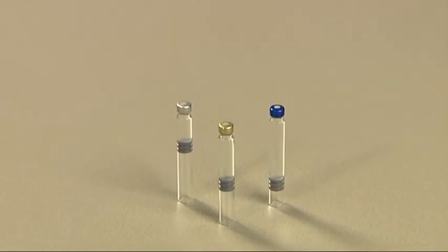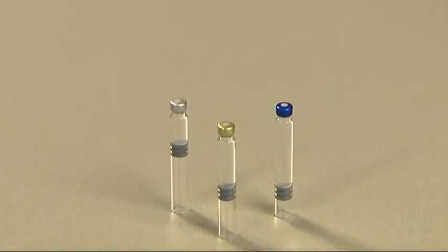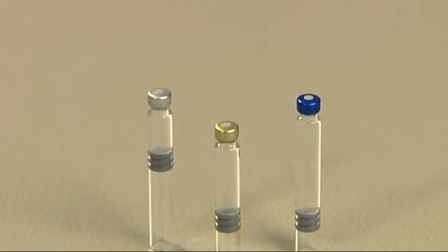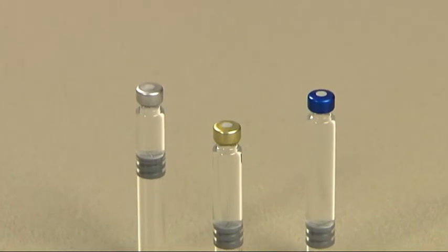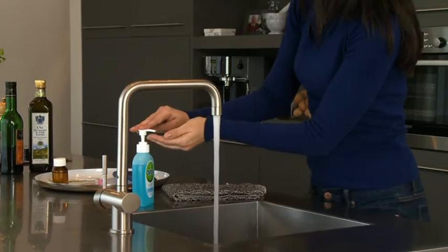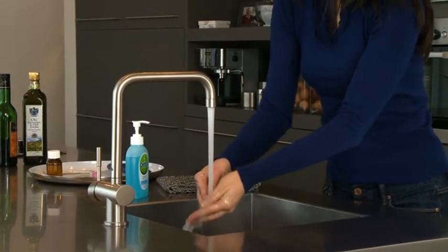In this programme, we will demonstrate how to inject a dose of Puragon using the 600 IU cartridge. Your doctor will have prescribed the appropriate cartridges for your treatment. Always wash your hands thoroughly with antibacterial soap and water before you begin.